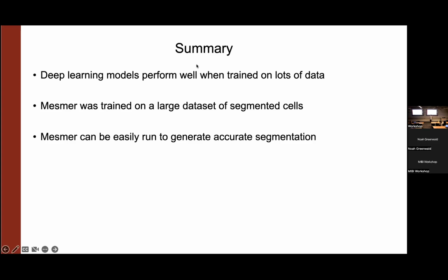expression on one part that would not be expected to be found with a cell that's also expressing the thing on the other part. Now I know to split this in half. That would require, though, training data where it's not just a single membrane channel. It's actually multiple different membrane channels. And the algorithm has to learn, when these membrane channels come together, it should be split apart.